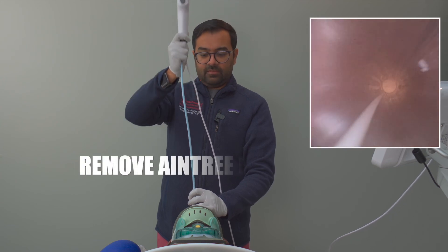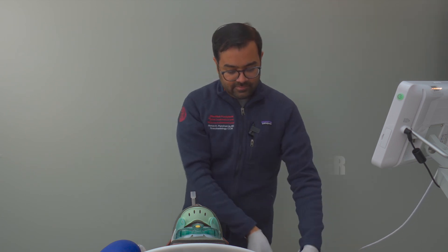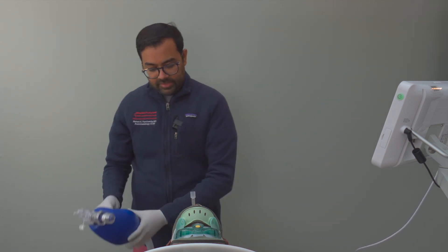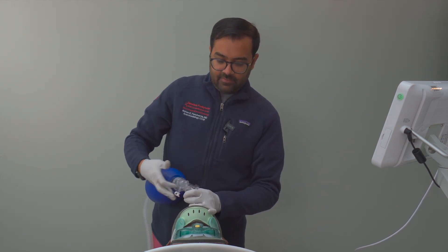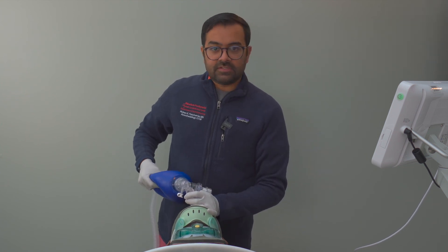You can pull the Aintree out, then the bronchoscope out. Inflate the cuff and connect to the BVM. Give a few breaths — and success.